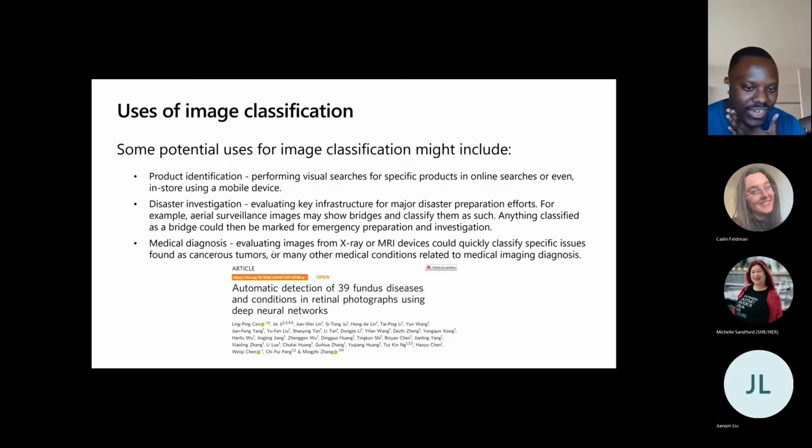If properly trained, and with the right doctors and imaging people working together, you can have a quicker and also more accurate diagnosis in the cases which teeter in between, because not everything is clearly a positive detection. Sometimes doctors, especially in those in-between cases, can say no further treatment is required, but it may actually be something that requires a referral. So that's where image classification can come in as a complement to helping health experts.